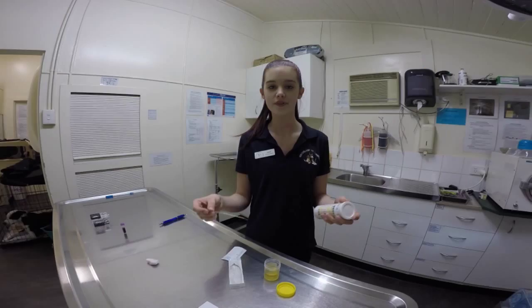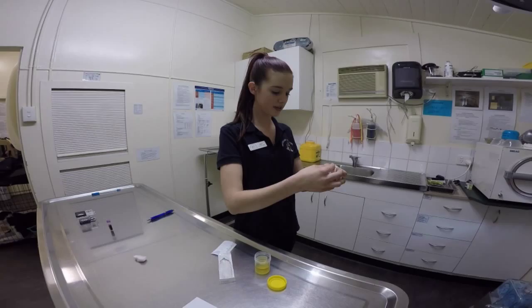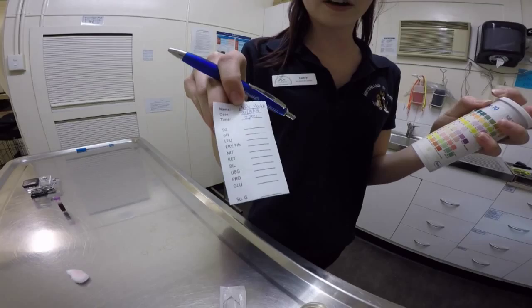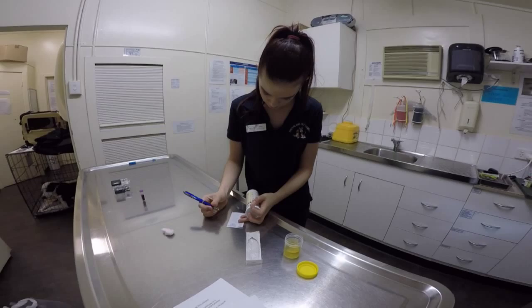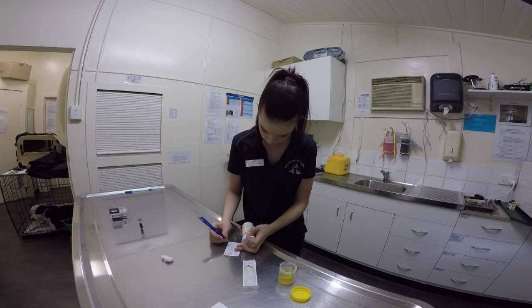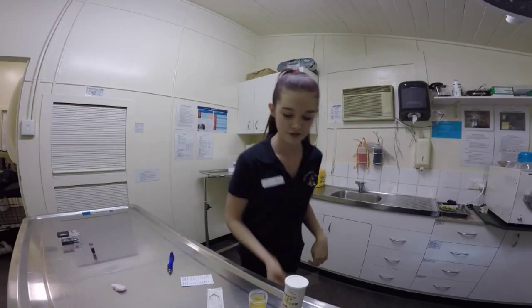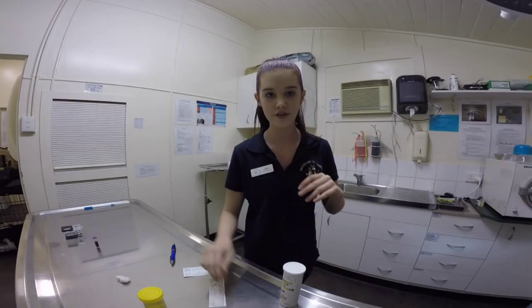Once it has been 60 seconds I will hold the dipstick up to the chart to compare the results. I will write down the results on a urinalysis card for the vet to evaluate later. Perfect. Now that I have finished the urinalysis I can throw the dipstick away. I won't throw the urine out in case the vet needs it for further testing. All rubbish will go in the bin.